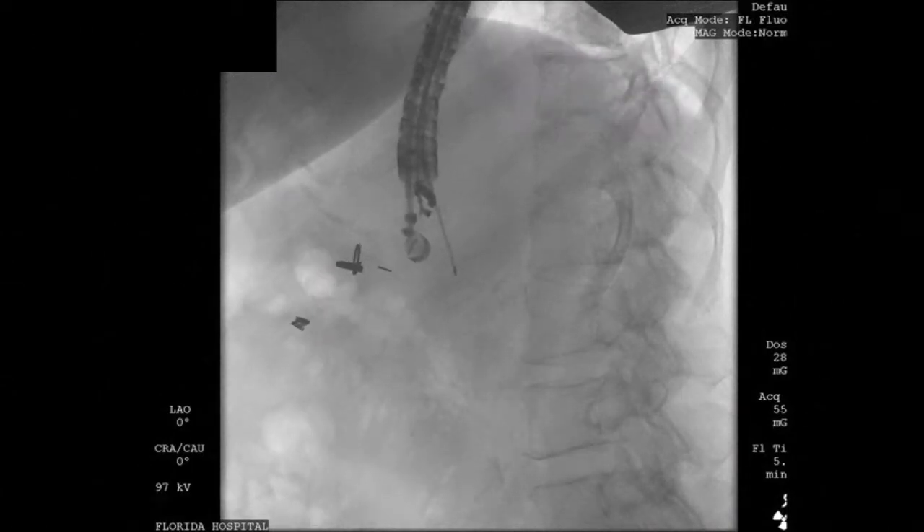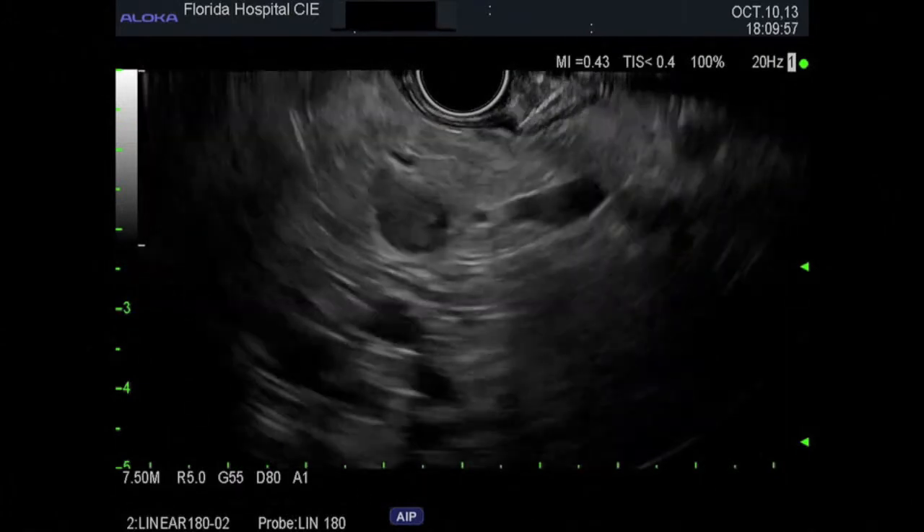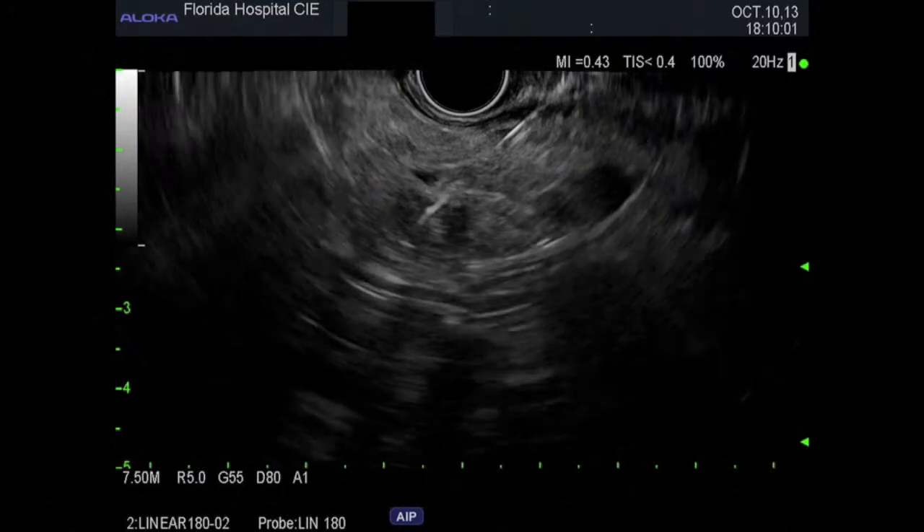The needle is then inserted into the tumour and the stylet is advanced to the tip of the needle, pushing the fiducial into the tumour under fluoroscopic and EUS control. This manoeuvre is repeated until the required number of fiducials have been placed.